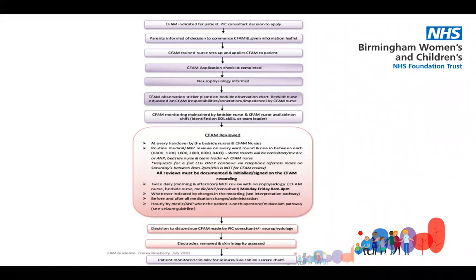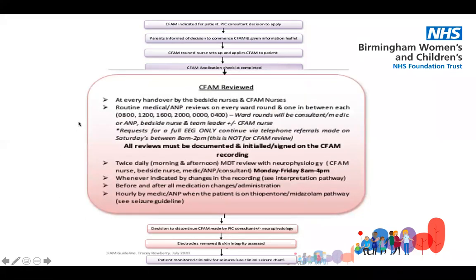And then it comes down to reviewing, and that's really the key, is that you have to remember these machines, although they do have an alarm system on them, we know that the alarm system is not great. It alarms at every little bit of movement and not just seizures. And so in the wealth of kit that's surrounding the patient, they can get hidden. And so we really need to remember to look at them.